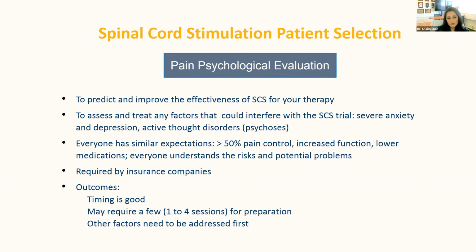For that reason, we really want to make sure that you are a psychological fit to have a medical device. That's why we will send you for an evaluation to make sure that you're going to respond appropriately. There are some patients who have so much depression they cannot determine if there's a response or not, and they probably are not a good candidate for this type of procedure. So we really want to prepare you so you know what to expect, and help you with your anxiety and depression, bringing that down prior to putting in or trialing a stimulator.